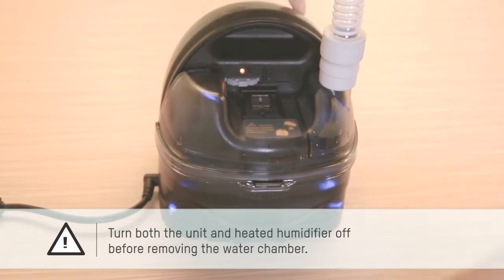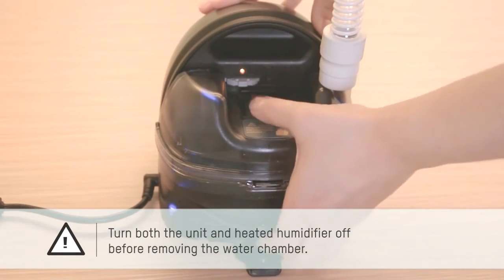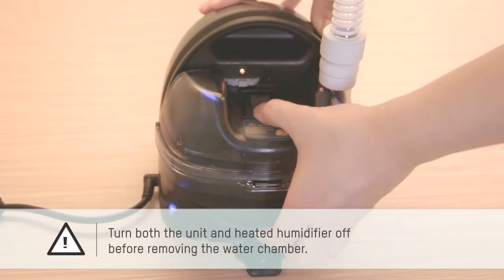Turn both the unit and heated humidifier off before removing the water chamber.